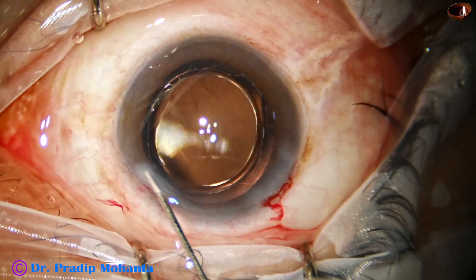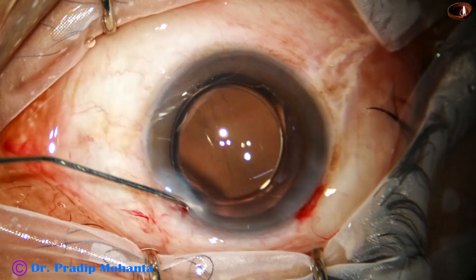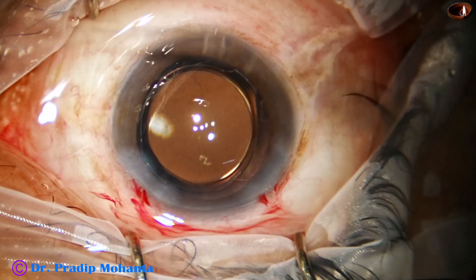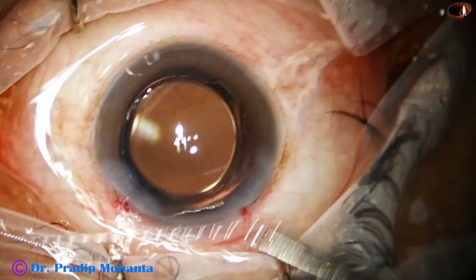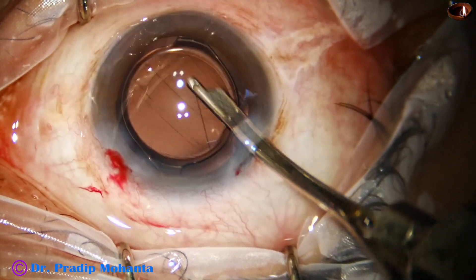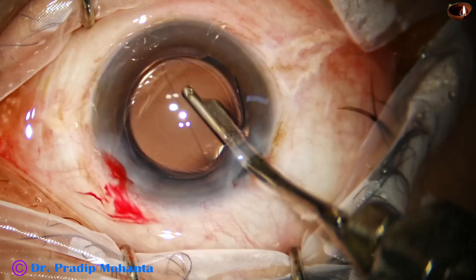Now this is closure of the side port, followed by final lavage and formation of the anterior chamber.